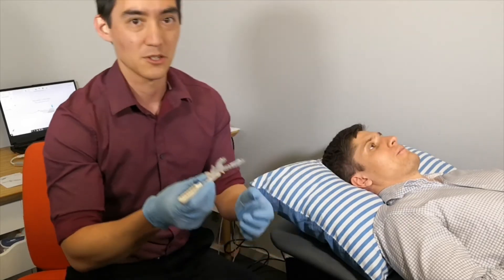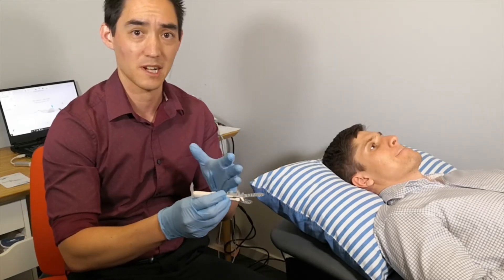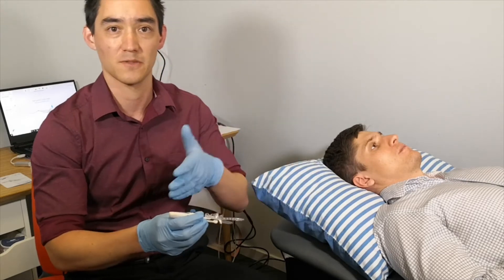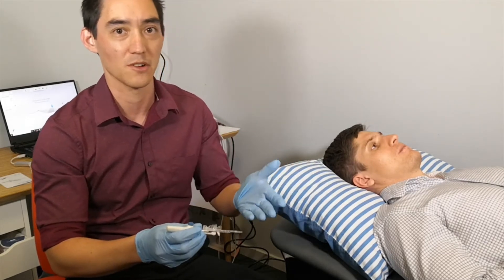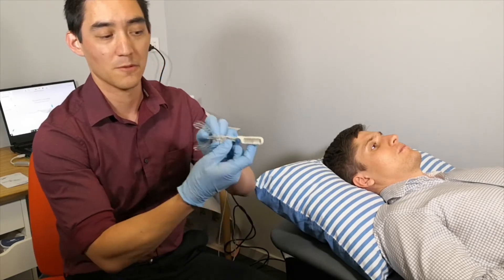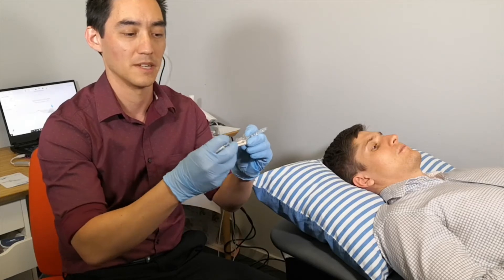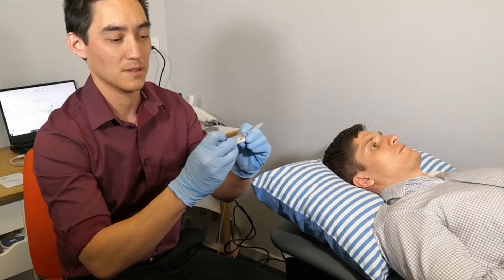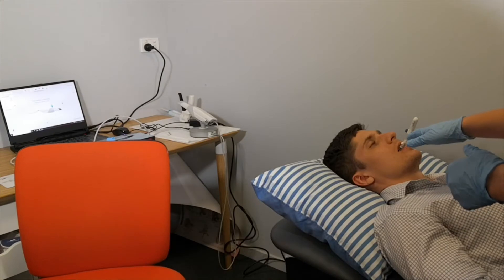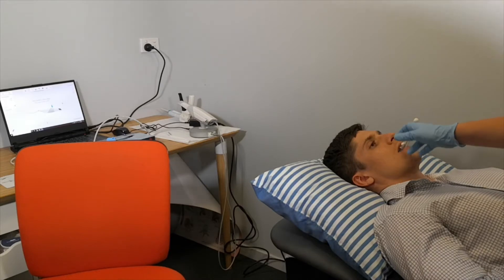Once we have those two measurements, we can figure out whereabouts we want to start. So if say Callum was plus five and negative five — negative five centric relation, plus five maximum protrusion — then zero is going to be about 50%. So if that was the case, we would find the zero or whichever number we want to achieve as the starting position and lock it in that position. Now that's determined where we want to start, we would put it back into that position. Now the important thing is to make sure the patient's midline is straight.